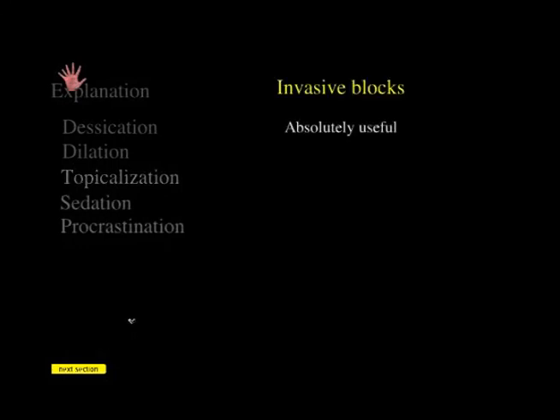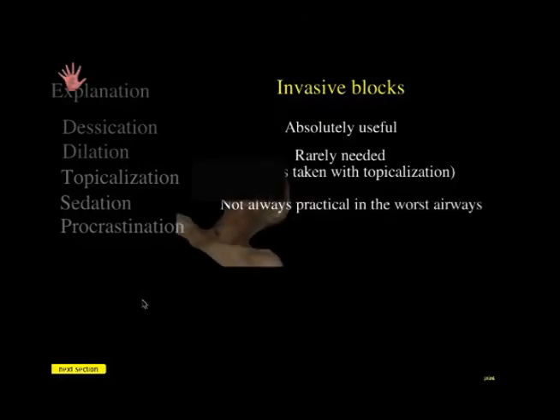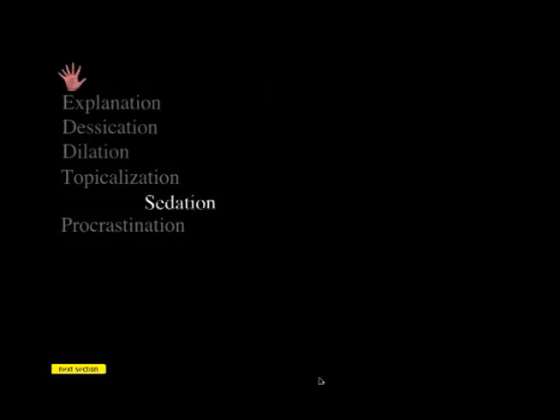Invasive blocks, absolutely useful. I find they're rarely needed if you take care with your topicalization. Not always practical in the worst airways. We saw this lady before. We're not going to be able to do an invasive block in here.